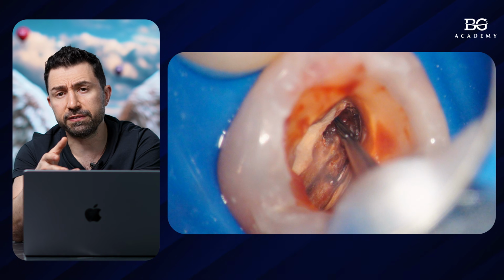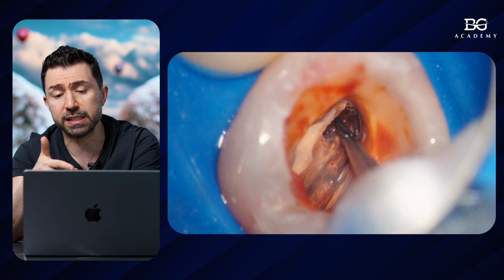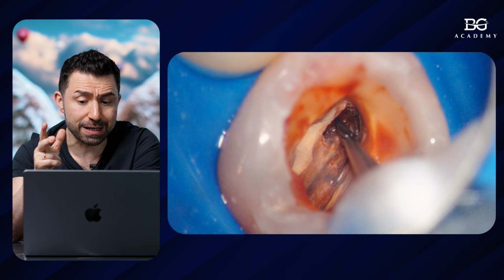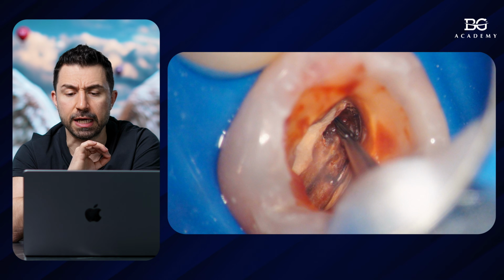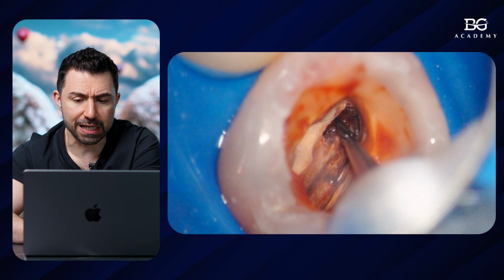You can use thin burs or thin ultrasonic tips to shave the isthmus, to clean the isthmus, to find the root canals. Like in this case, we use a special carbide, a very thin, long-neck endodontic bur, to clean up the isthmus and to preserve as much sound tooth structure as we could in such cases.